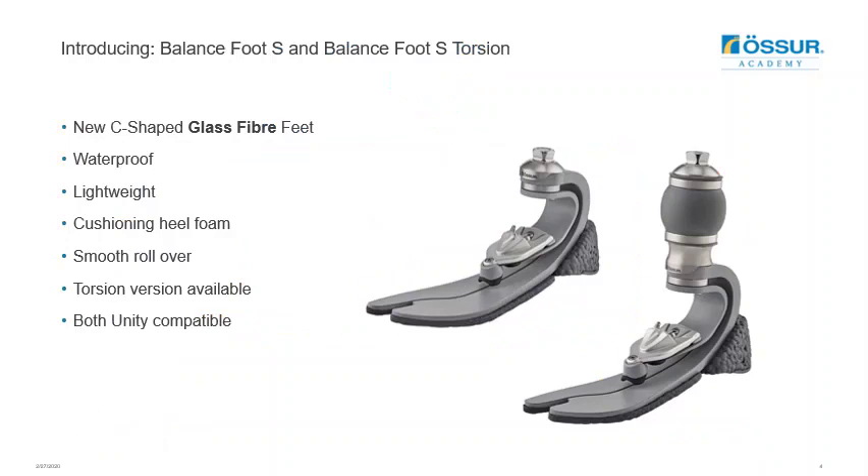The new Balanced Foot S and Balanced Foot S Torsion are C-shaped in design and are made from glass fibre, offering a lightweight and warp-proof solution for low active users. The cushioned heel foam offers gradual stiffening in combination with a wide foot blade for stability, contributing to a smooth rollover. A torsion version is available to provide additional shock absorption and rotation, helping to provide increased protection to the user's joints and residual limb.